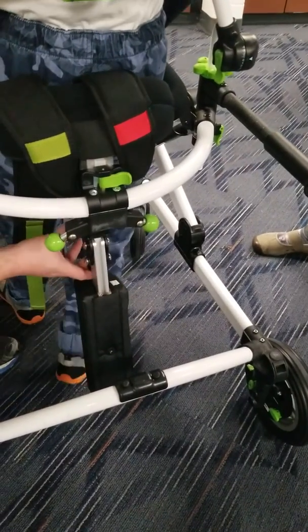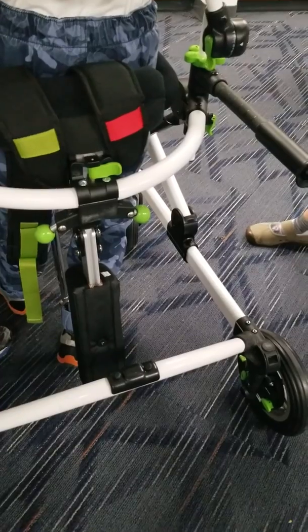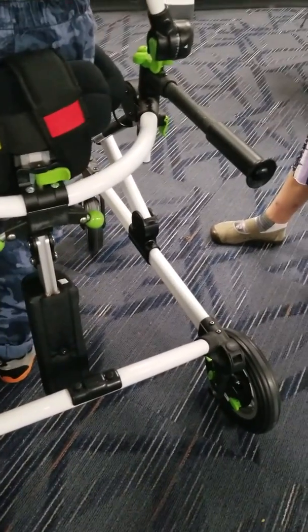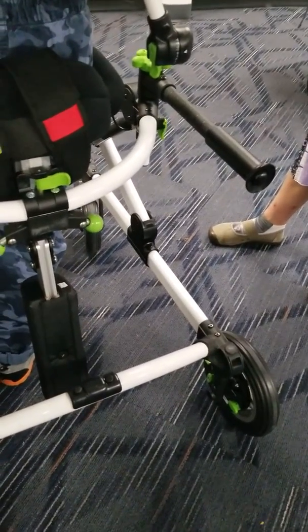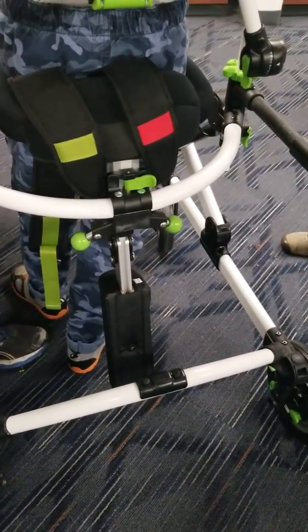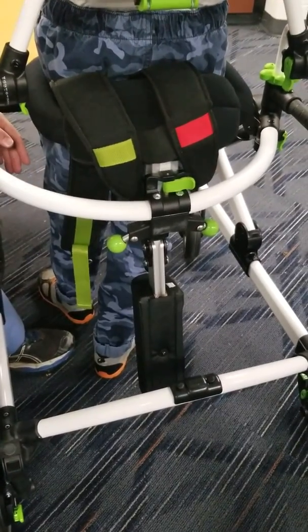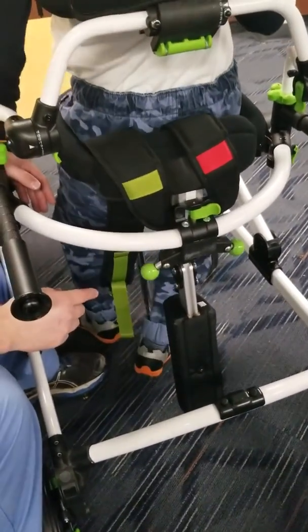That's okay. Sorry. So the goal is, if we're doing 5 minutes a day, the hope is that he wouldn't need the pommel. And truthfully, at home, if he's showing that he's tired, then we just say, okay, let's get on. And I think these straps are doing a very similar role as the pommel.